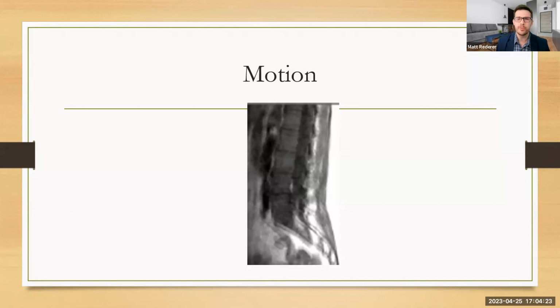If it's for peristaltic motion, we probably wouldn't stop it, because most of the time, unless we're doing an enterography exam, we're not imaging the bowel. So if it's moving, there's tricks we have. We can acquire data very fast, and if we image fast, we can beat that peristaltic motion because it moves very slowly. This motion for the bowel is very slow. We can usually beat it with imaging fast. So there's tricks up our sleeve that you guys will learn next semester.